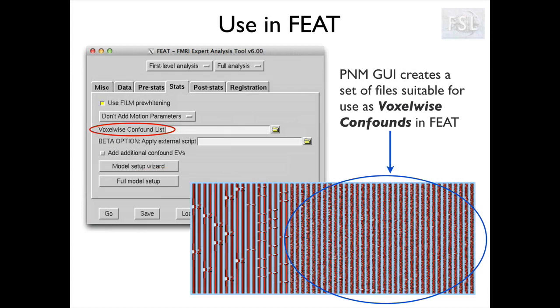PNM generates a lot of regressors. Because different slices are acquired at different times, we are going to have different sets of regressors for different slices, and they will be stored as images. So we need to add them as voxel-wise confounds in our first-level GLM in FEAT. You are not going to see them explicitly when you set up your design matrix, but this is what happens to your design matrix when you add these regressors.